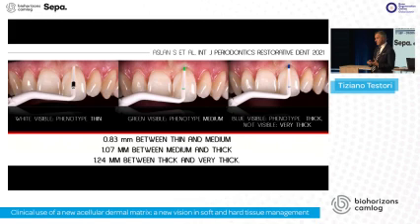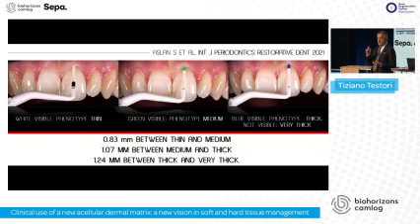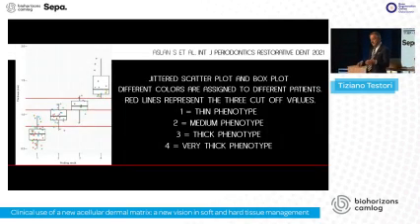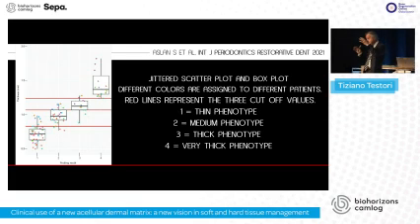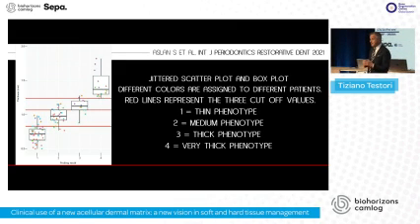And this is very important in order to avoid unrealistic expectations, because when we use these matrices, clinically it may be very difficult to differentiate the thickness only by looking at the patient. We know that we are within this range from 0.5 to 2 millimeters, but thin versus thick makes the clinical difference.